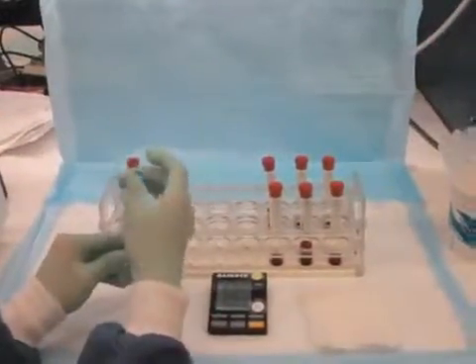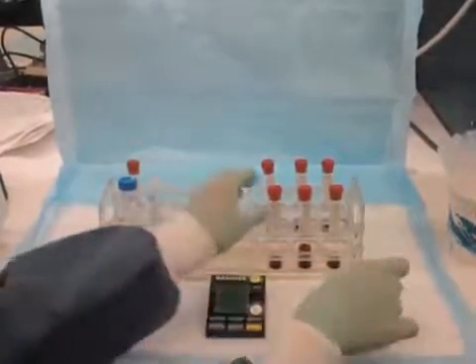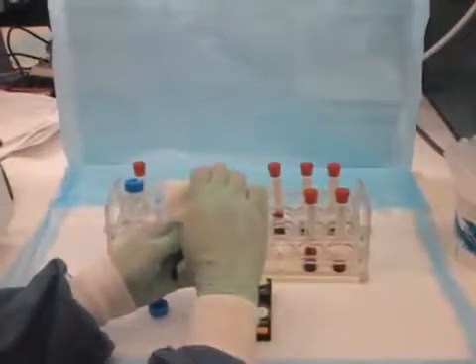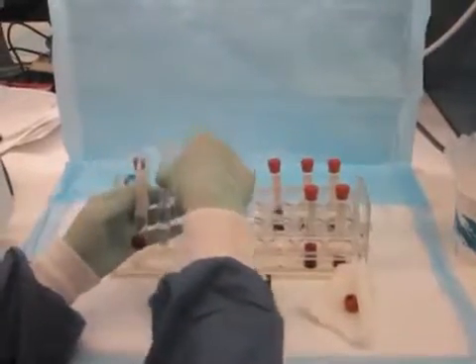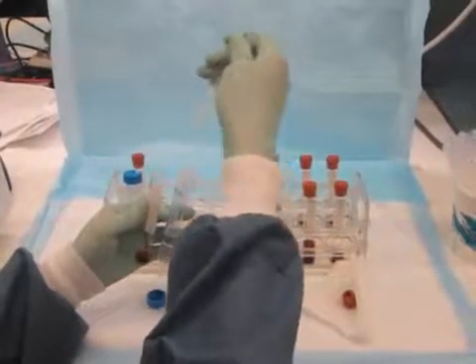Protecting. This stage involves isolating the red blood cells and then treating them with a cryoprotective agent. Begin with an anticoagulated whole blood sample. Isolate the red blood cells and wash them repeatedly in 0.9% saline until no hemolysis is present in the supernatant.